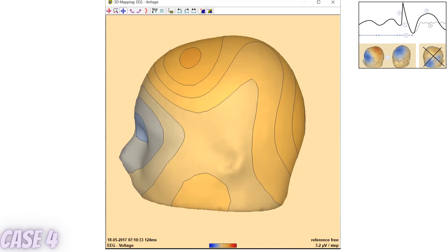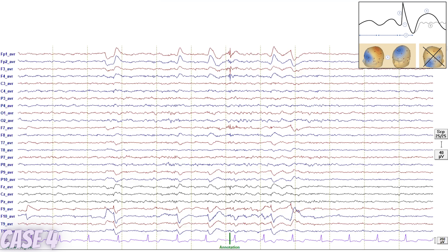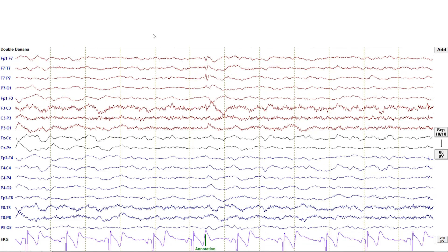Got it. This would be a very weak firing of a rocket. It wouldn't even make it out of the brain, or many, many small RPGs firing here and there. Exactly, but it doesn't make sense from a physiological perspective. Can we go back to the EEG Sandor and understand why there's no field to it? Just look at the EEG, not the voltage map now. This is probably a muscle artifact, so the distribution on the voltage is completely different than if it had been generated from the brain. So remember that there is some smearing because of the skull, and that's why you have these very nice voltage distributions if the source is from the brain, which is not the case here because the source is actually outside the skull.